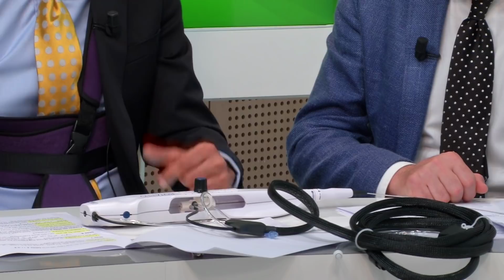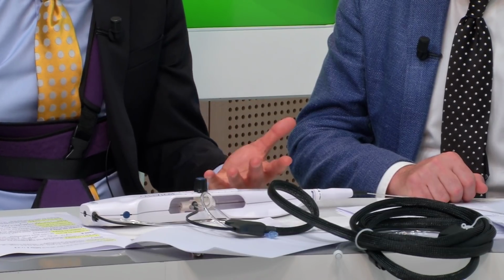The alternative technique, if you've tried that and really given it a good pull, because this is bonded very well to the shaft, is to use the parallel guide catheter technique. The ping pong technique, where you get an alternative access, send through another guide catheter, pass a wire down, and then get a balloon down beside the burr to dilate and release the tension in the vessel to pull the burr back, and that is effective too.